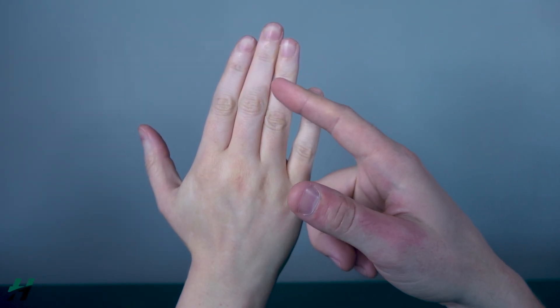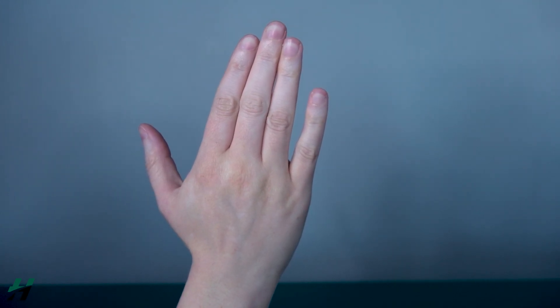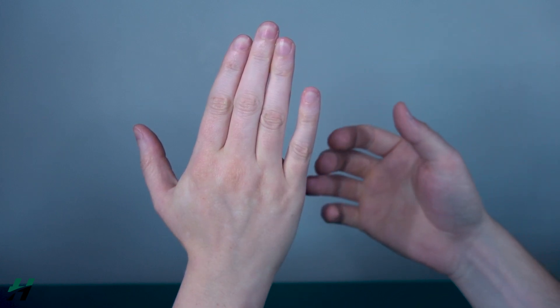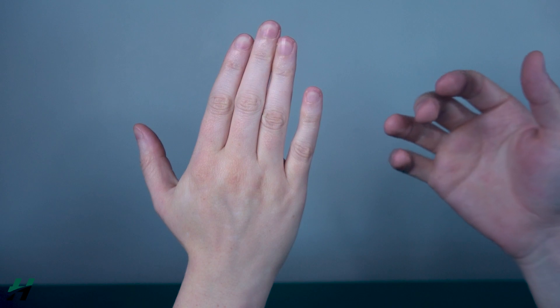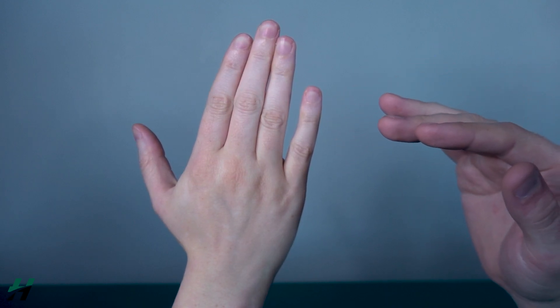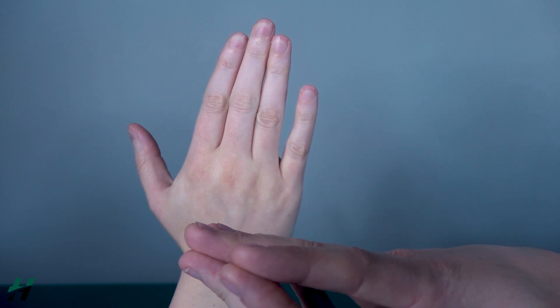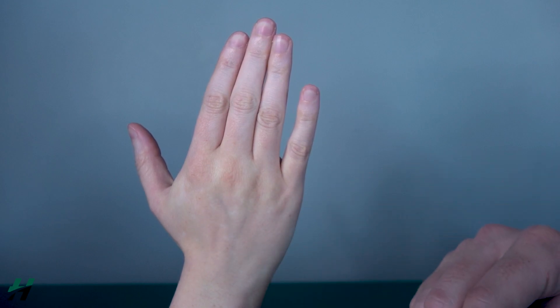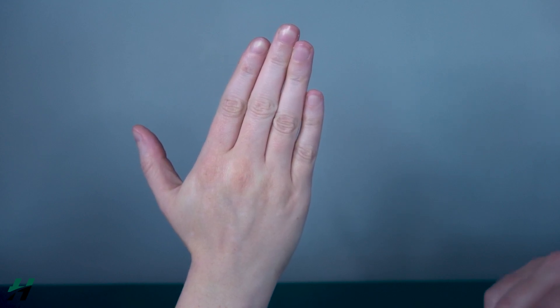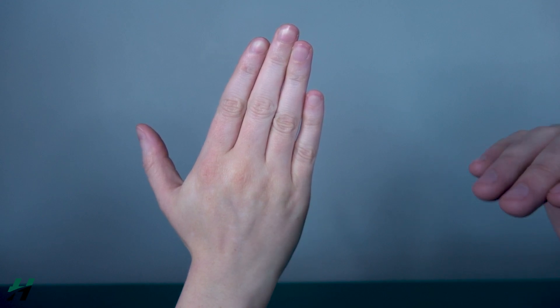Measuring PIP and DIP extension: the patient will be in a seated or comfortable position. The hand can be resting on its side on the table or held upright — any position works. However, make sure the fingers are not resting against an object that would promote more extension than they actually have, so be careful about that.